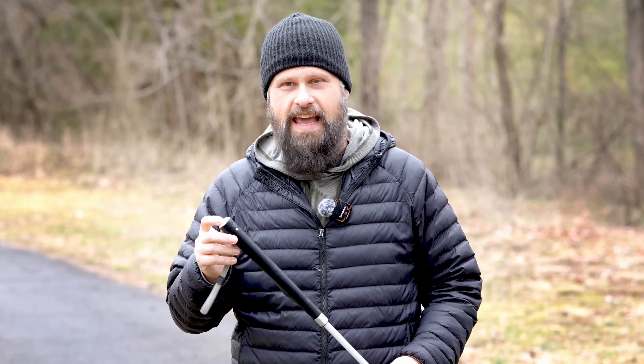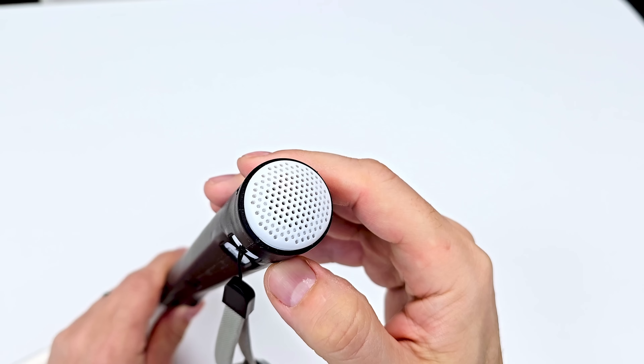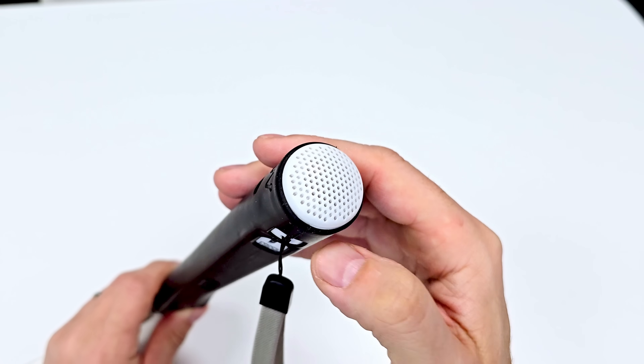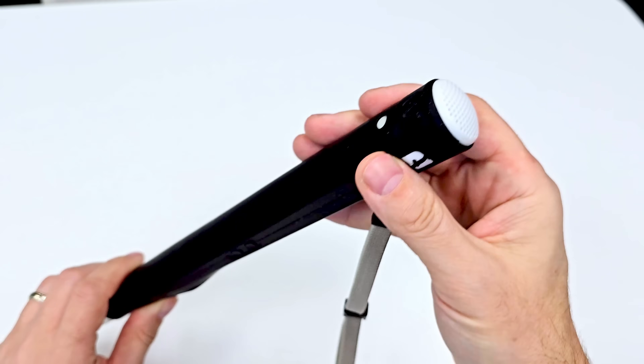Next, we have a new improved speaker on the WeWalk Cane. The speaker not being loud enough was another criticism of the predecessor. But now, right here at the end of the grip, you have a giant Harman Kardon developed speaker that should provide extremely loud and clear audio in a wide variety of situations.